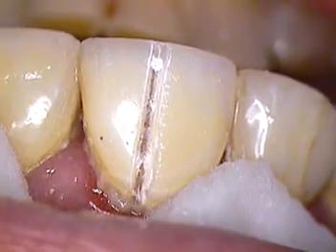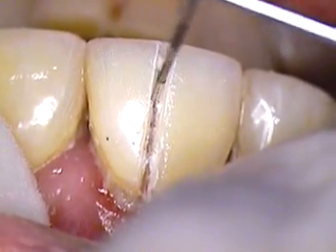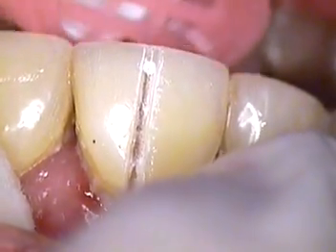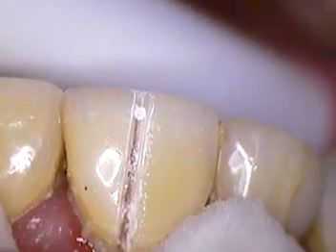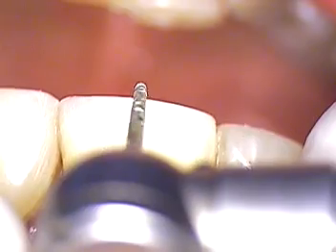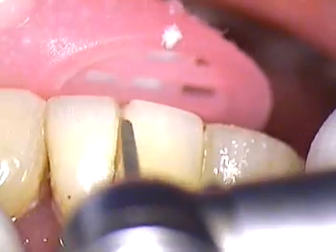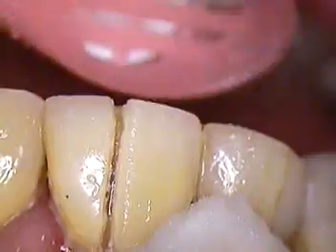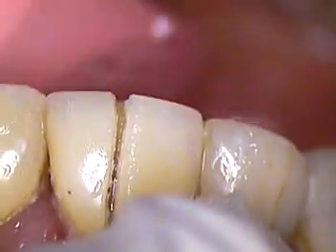And we're going to use a periodontal probe right now, and we're just going to check the thickness. My goal is to try to prep it to at least 1 millimeter in depth, if not a little bit more, so we can get a better profile. But we need to get the veneer off first to do that. And it appears to be some incisal coverage there, and that goes in about 1 millimeter.